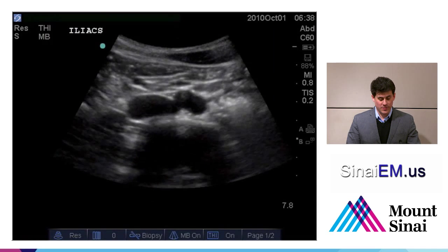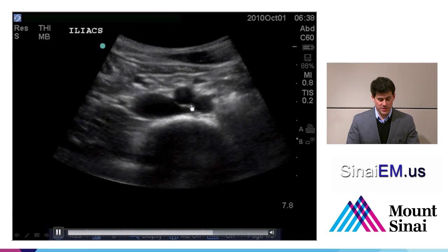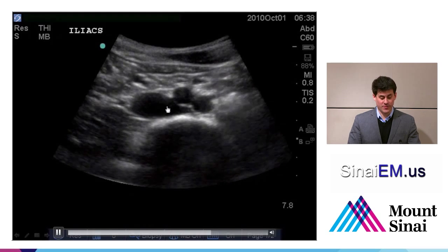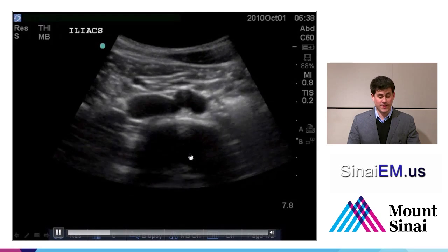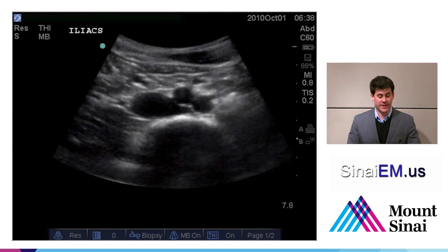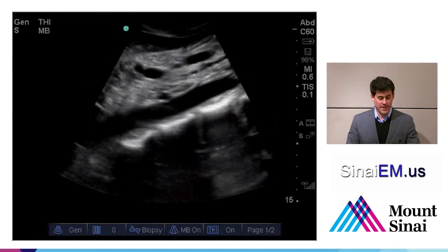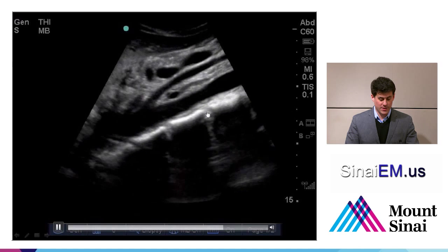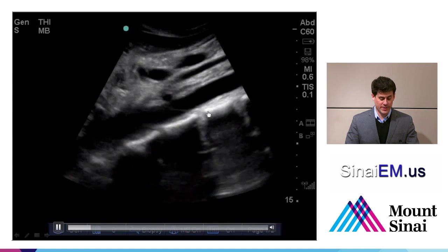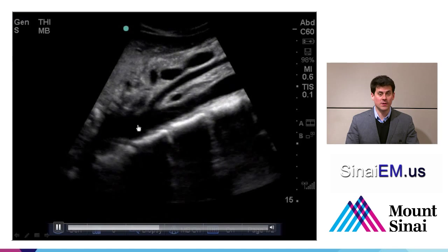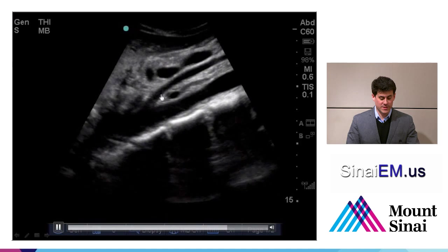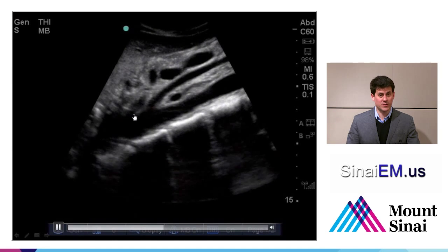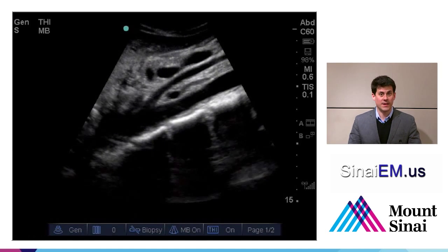Here we see an example of the iliac vessels: the iliac arteries and the distal IVC, which has not yet bifurcated. It's really important to visualize the iliacs because aneurysms can affect them. In a longitudinal sweep through the proximal aorta, we see the vertebral bodies with their bright anterior edges and posterior shadowing, the anechoic aortic lumen, the superior mesenteric artery coming off, and the celiac axis coming off more proximally toward the patient's head on the left side of the screen.